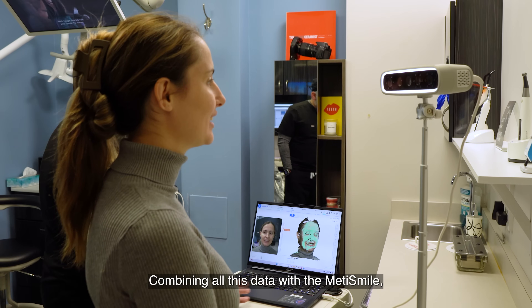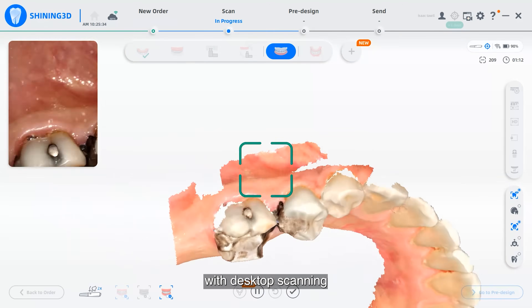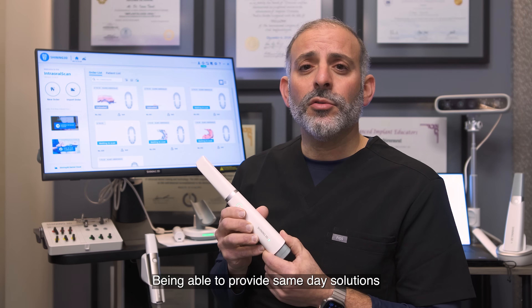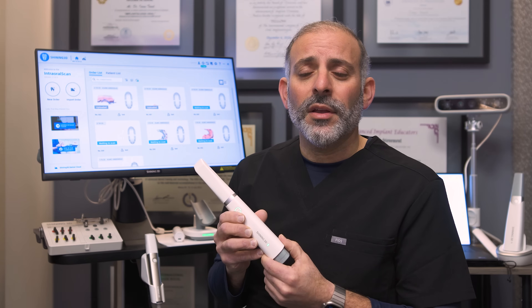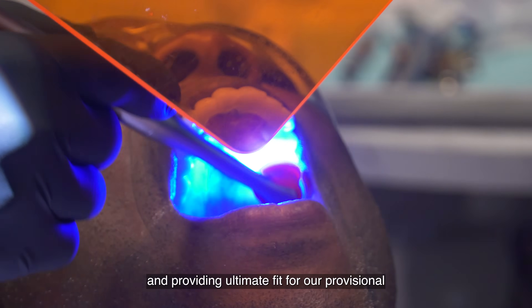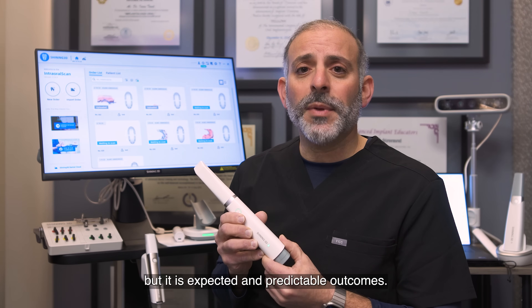Combining all this data with the MediSmile, with the intraoral scan, with desktop scanning, along with CBCT integration — being able to provide same-day solutions with proper midlines, correct occlusion, alleviating any canting or missed corrections, and providing ultimate fit for our provisional and final restorations — is now not only achievable, but it is expected in predictable outcomes.